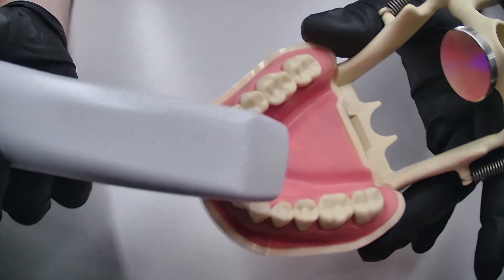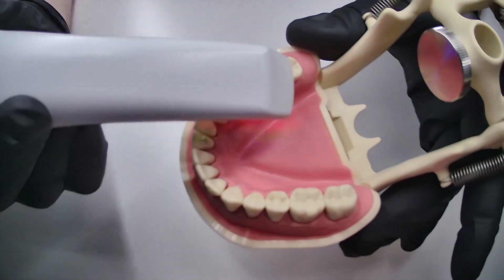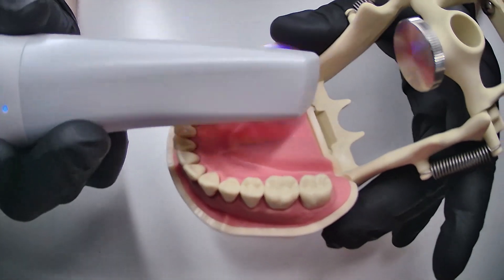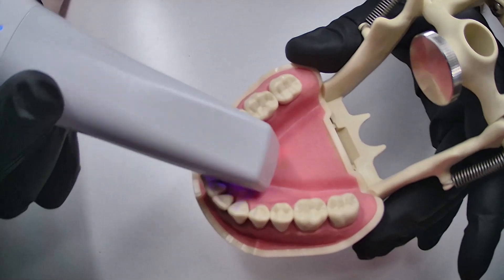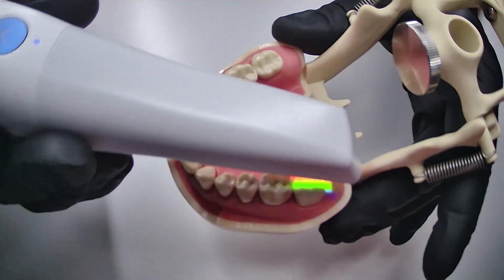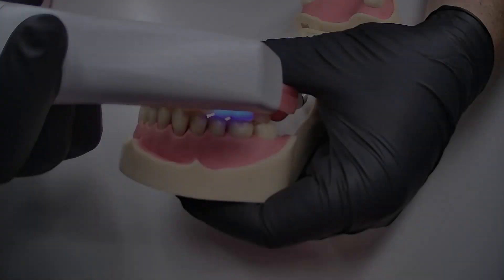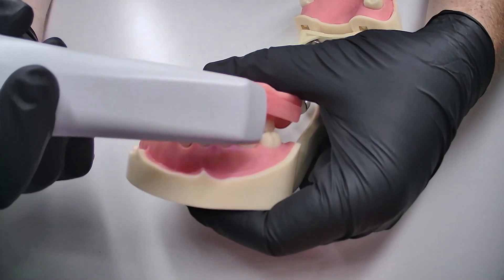Next, we will scan the opposing arch — in this example, a typodont is used as a stand-in for the patient. Then we will place the denture back in the patient's mouth and perform a bite scan and export in bite relation.